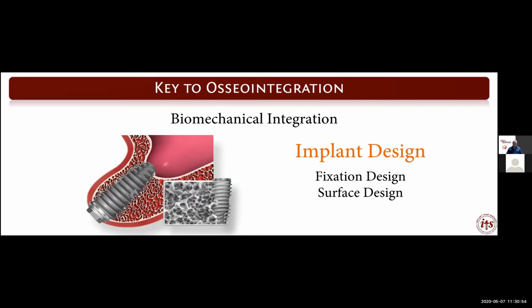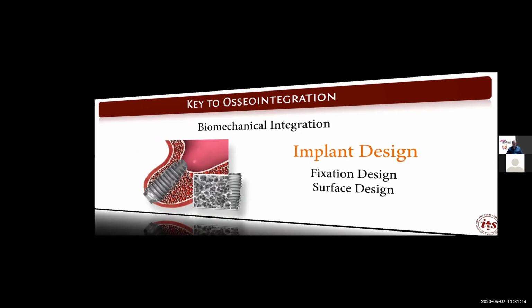The major challenge for contemporary dental implantologists is to provide oral rehabilitation to patients that are asking for rapid loading protocols or to patients with compromised bone. And the implant design is especially important to deliver a very biocompatible implant.